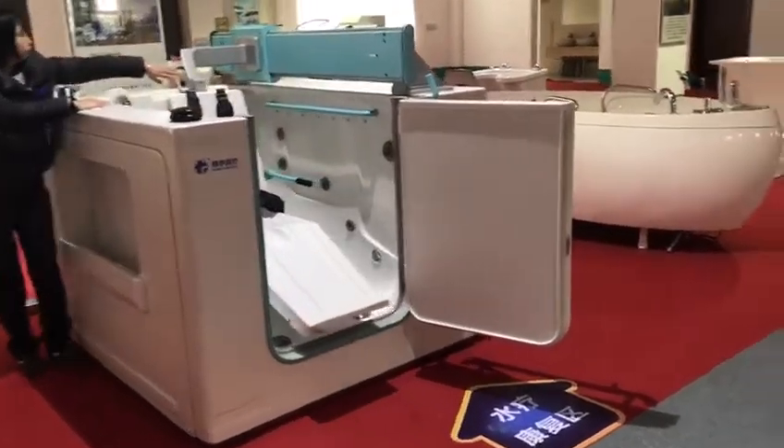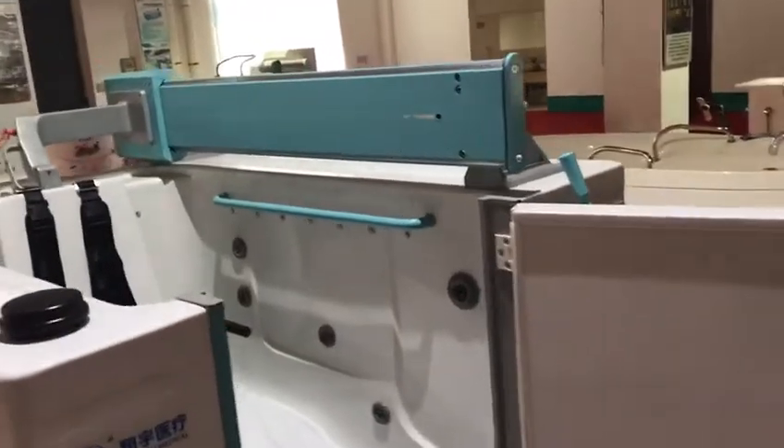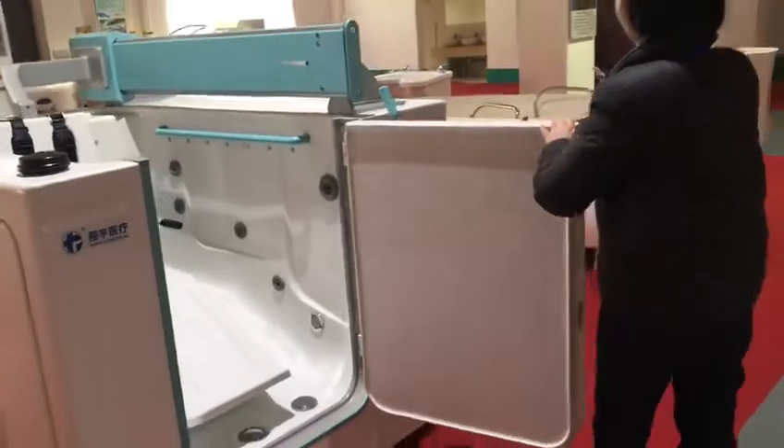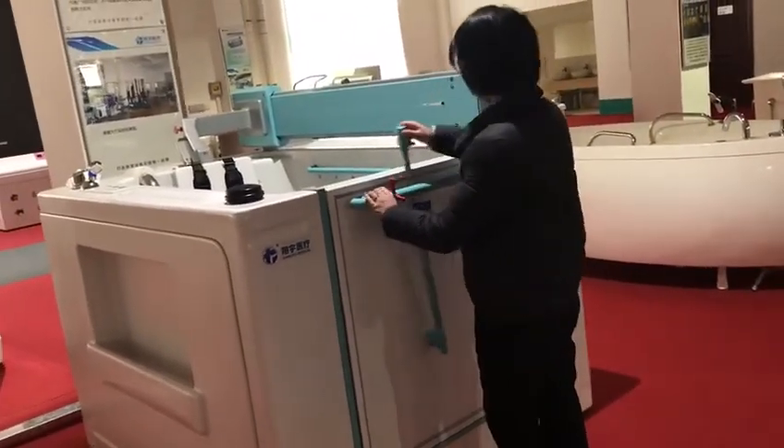You can see the slide is very smooth and it's very easy — no need for too much strength. Close the door, and there is a safety lock.